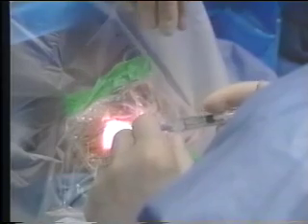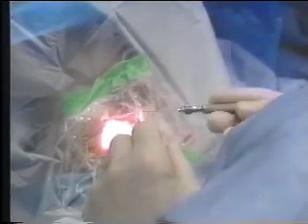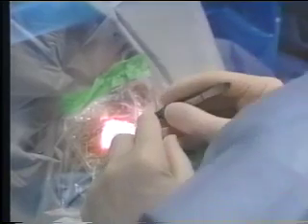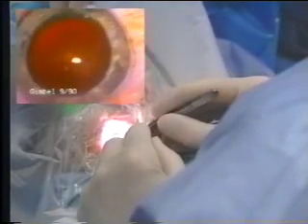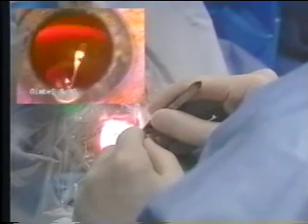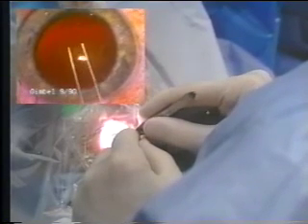At this point one has to decide whether to use the capsule forcep or the cystotome. Usually the central puncture is made with a cystotome, but with the newer capsule forceps with a more sharply pointed end, the initial opening can be made — as you will see here — by just pinching the capsule centrally.